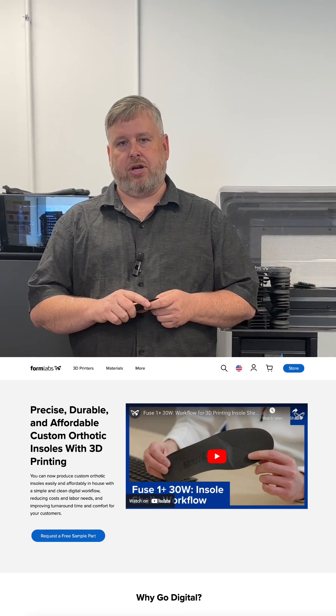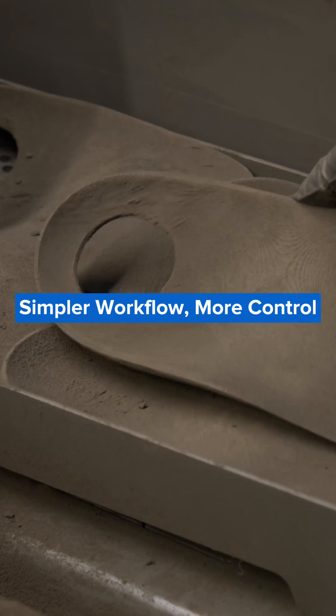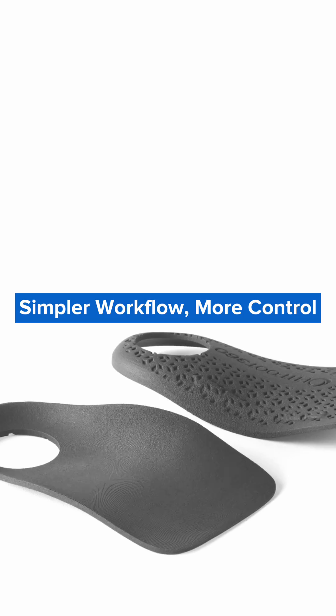Hey there, I'd like to invite you to check out our website on 3D printed insole production. Formlabs' healthcare team has dedicated a lot of time into developing a workflow that supports the production of custom insoles at scale.